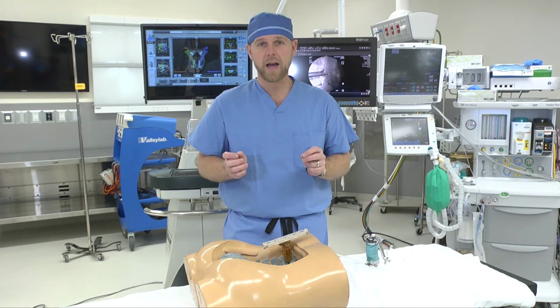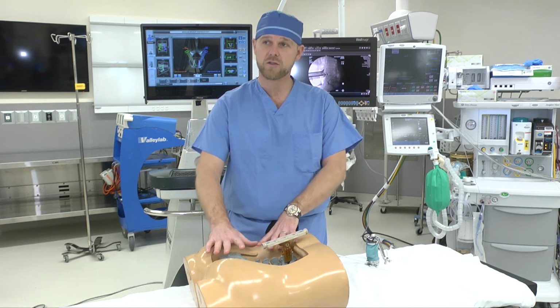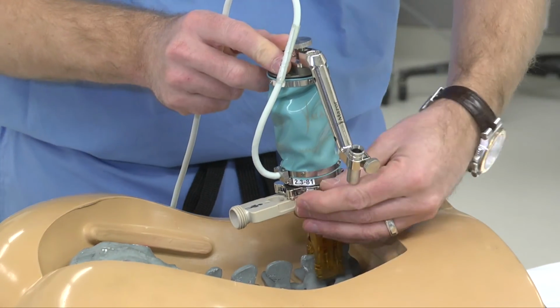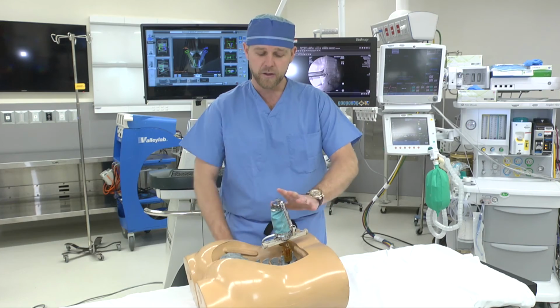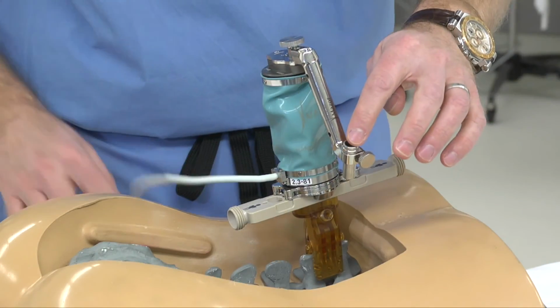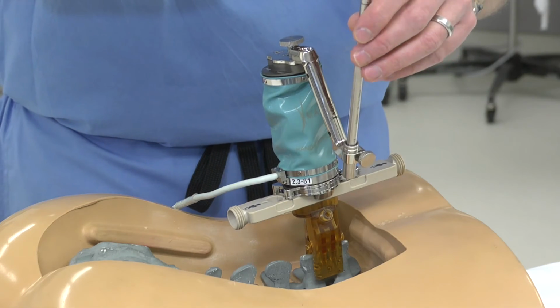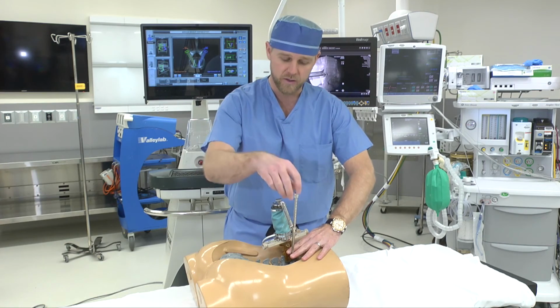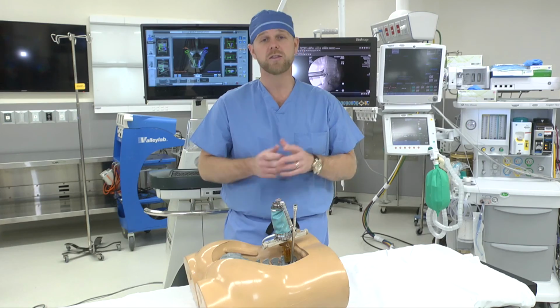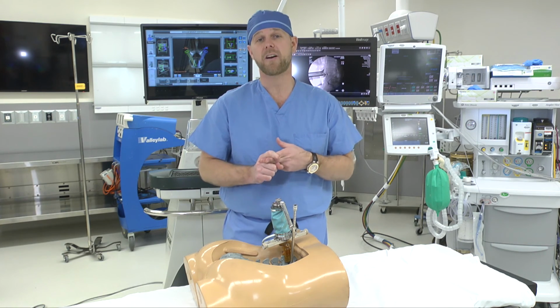When we perform a robotic, minimally invasive spine surgery, we don't have to cut open the skin or detach the structures from the spine. We're actually able to mount the robot near the patient with the skin intact. And then the robot moves and guides us. It helps us to work to a precise location underneath the skin without ever actually dissecting in and seeing it. And then the robot guides us using teeny instruments through little incisions to work down to the level of the spine without actually ever opening everything up. So that allows us to do smaller incisions, safer surgery, and get people out of the hospital faster.